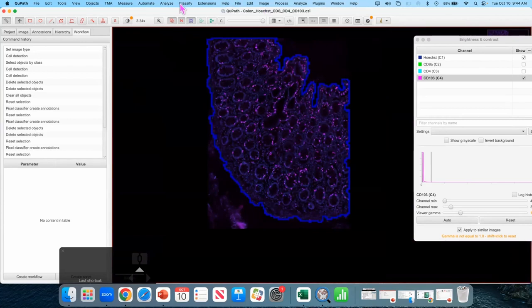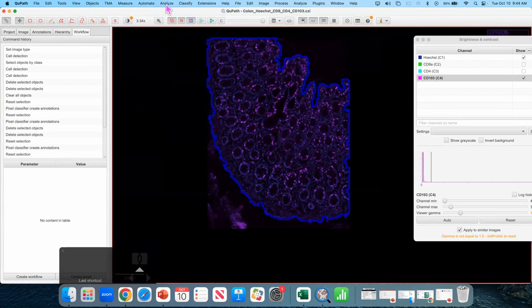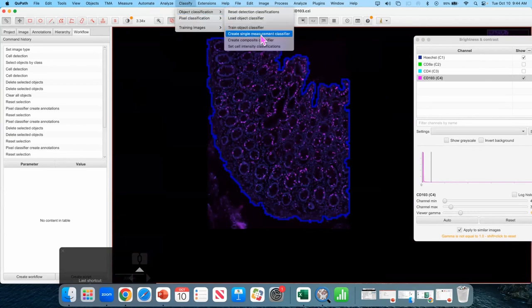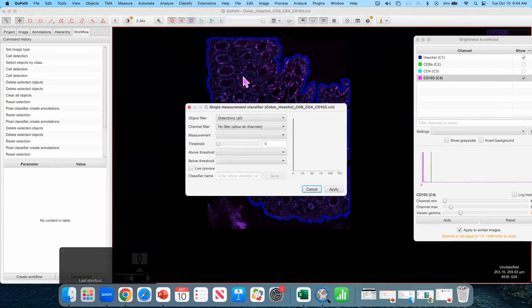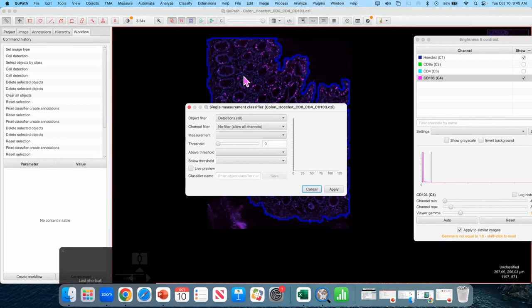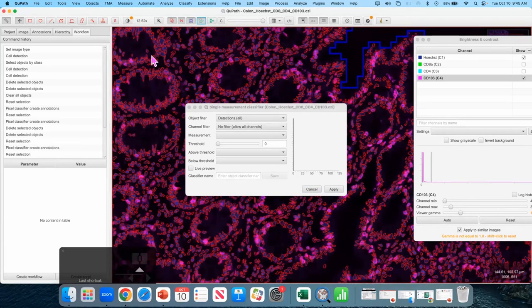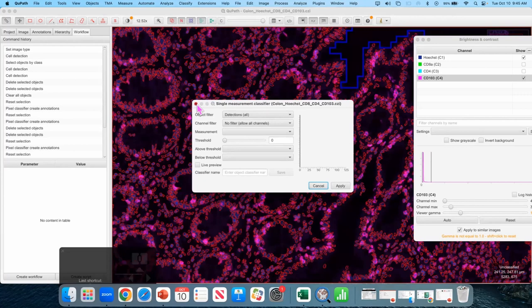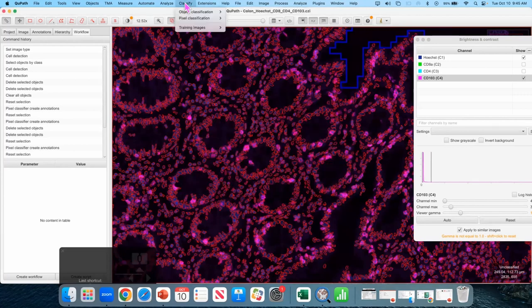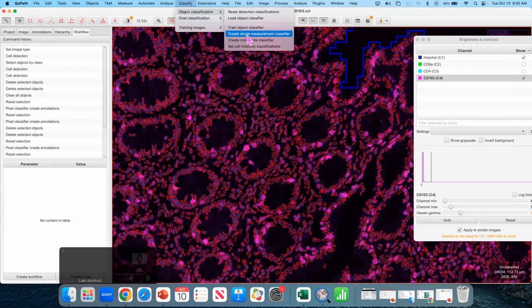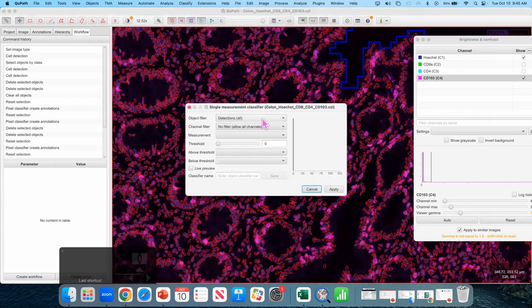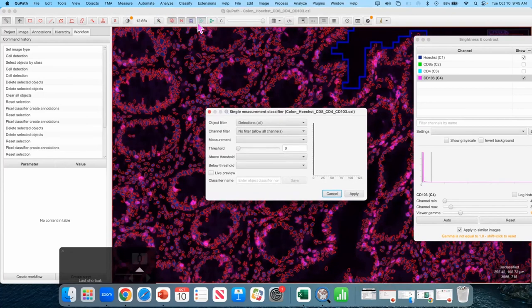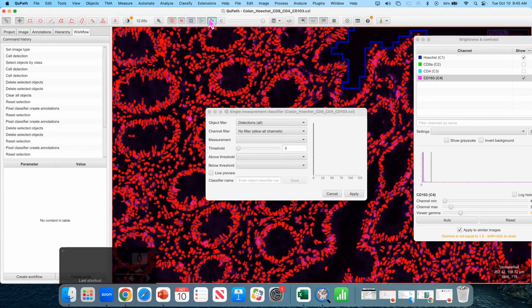So we want to find the CD103 positives. And we're going to do that with a pretty simple classifier called the threshold classifier. Mike showed this at the very beginning yesterday. Classify object classification. Create single measurement classifier. So now instead of looking at the pixels directly we're only going to be measuring the cells that have already been segmented. So it's important that you've done the cell detection otherwise nothing's going to happen in the screen at all.